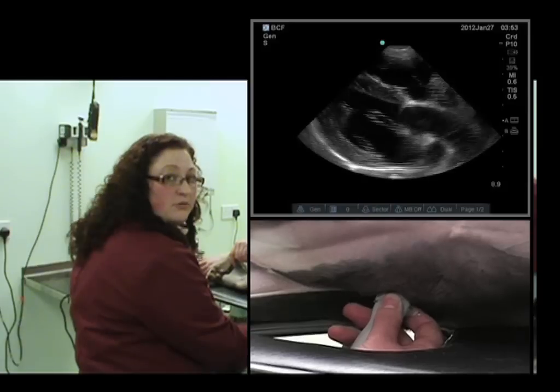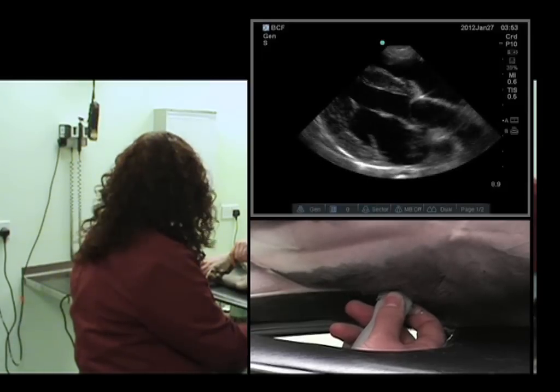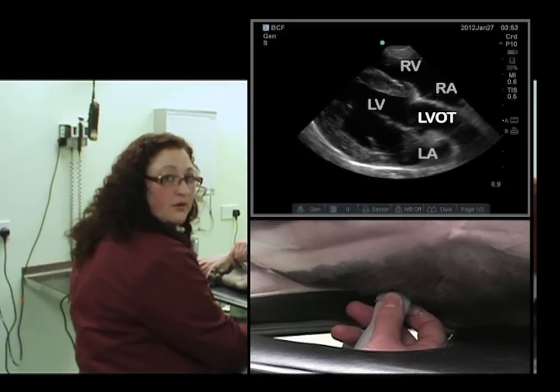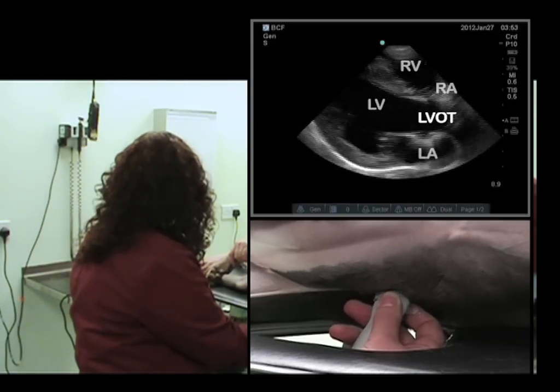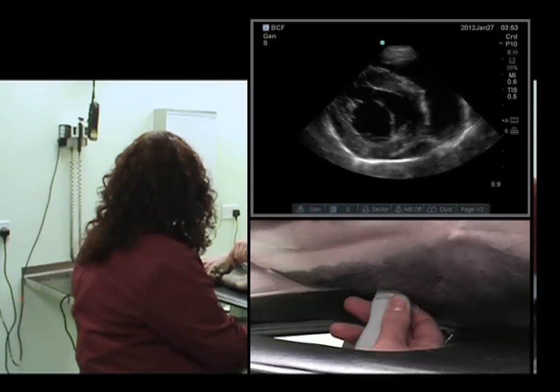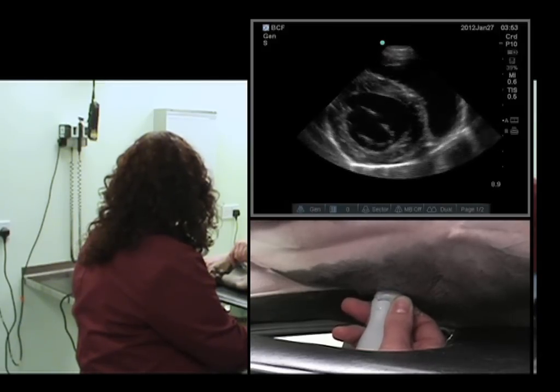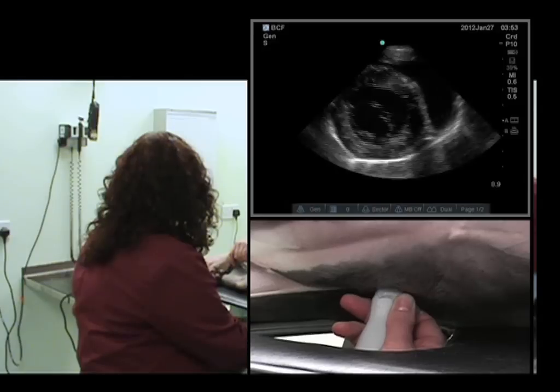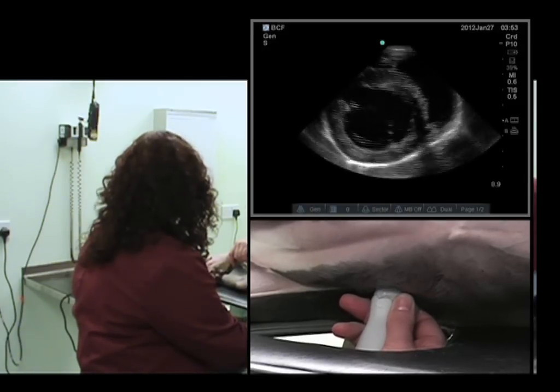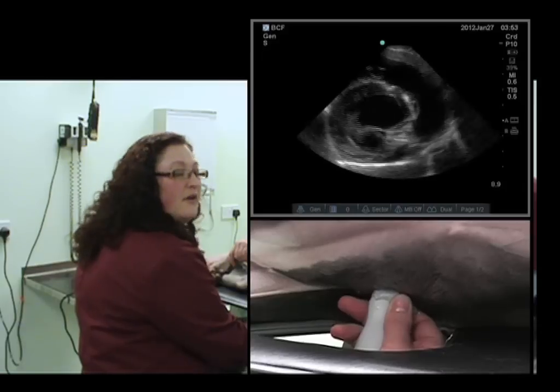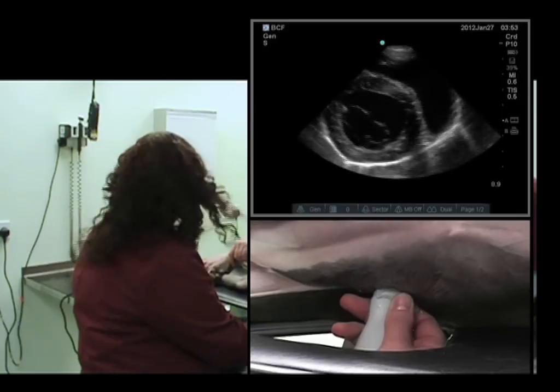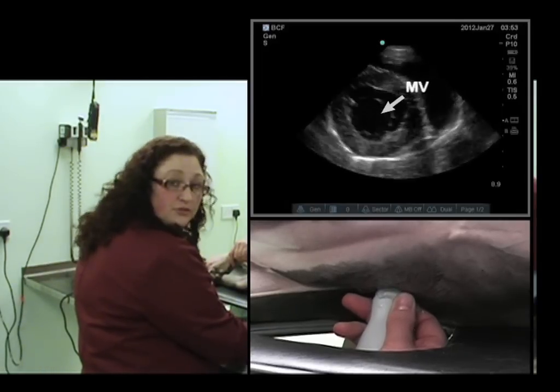We will see our 5-chamber view start to come into play. We now have the aortic outflow tract with the aortic valve. We'll keep rotating until we're in a short axis view. Right now we're at the level of what some people term the fish mouth — what we're actually seeing here are the mitral valve leaflets.